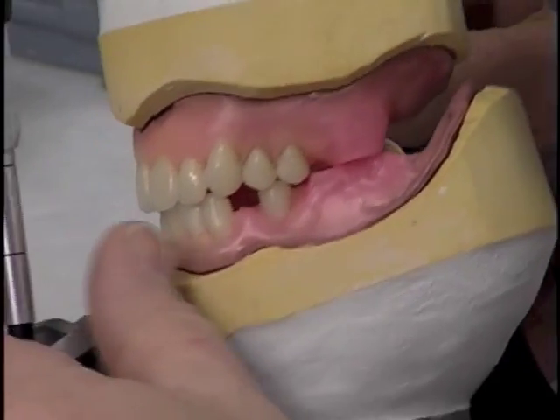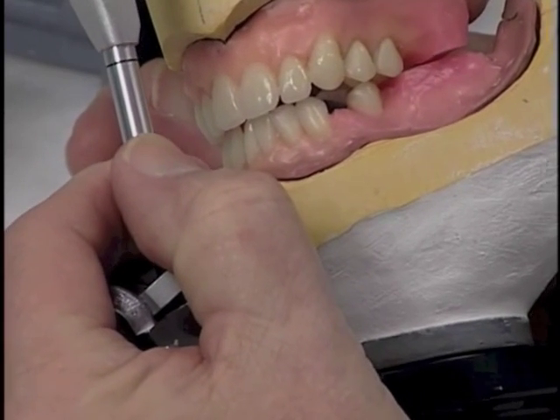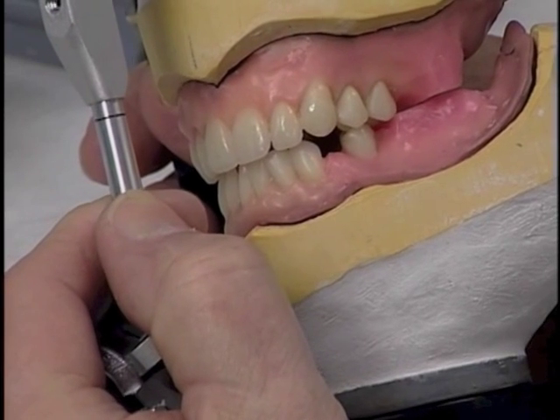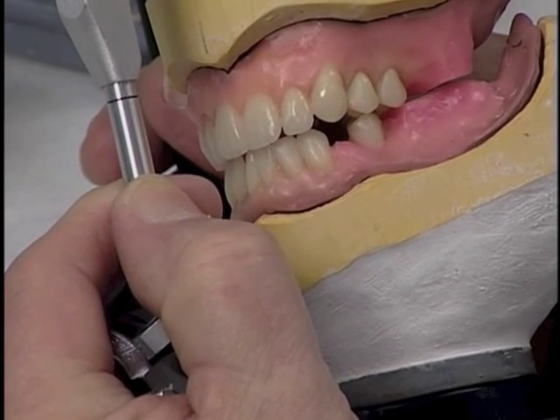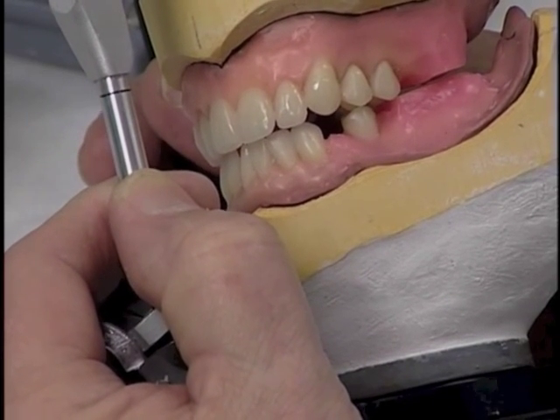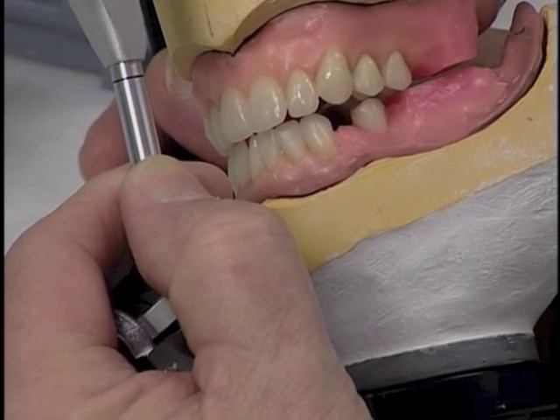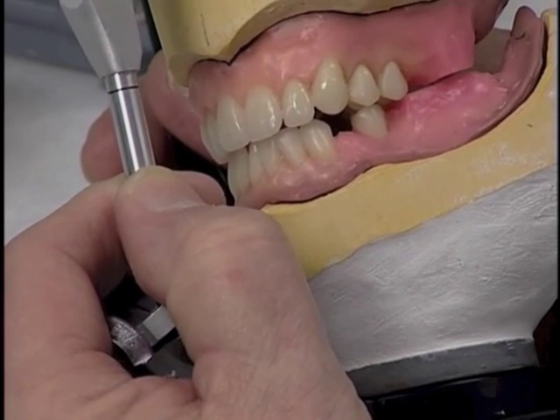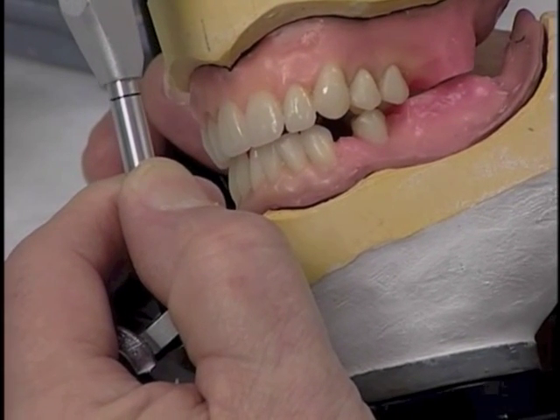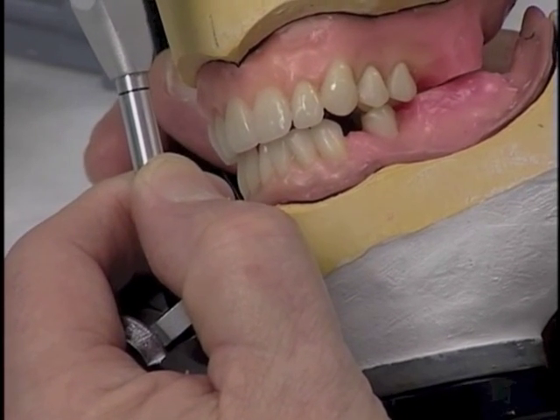At the same time that we're having that contact, we must also note that when we move the articulator into balancing side, or the non-working side, we are maintaining contact of the maxillary lingual cusp of the maxillary first premolar with the buccal cusp of the mandibular second premolar. So we actually have, with those 3 teeth, begun to create a cross-arch balance.